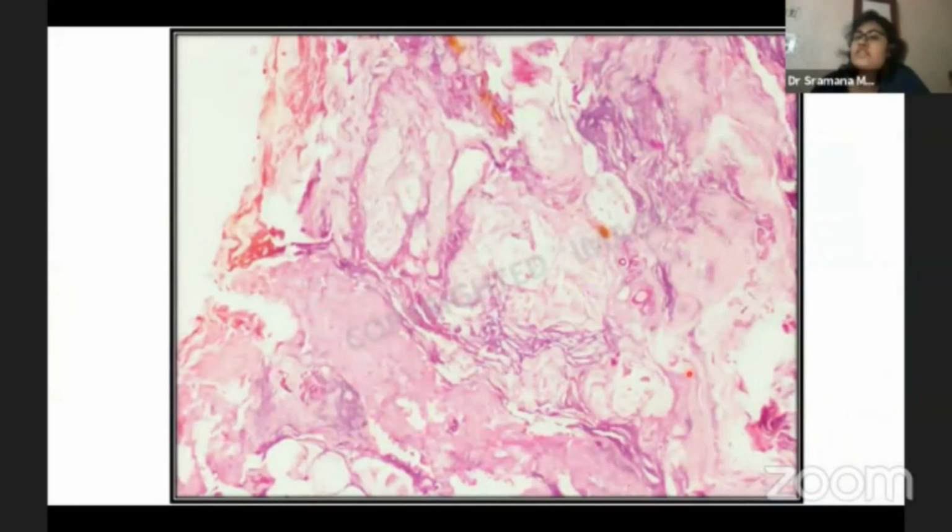What is the host tissue pattern that they produce? So Mucorales in acute fulminant mucormycosis can produce bland infarction. Now, when we say bland infarction or necrosis, we mean that we are not seeing inflammatory cells.